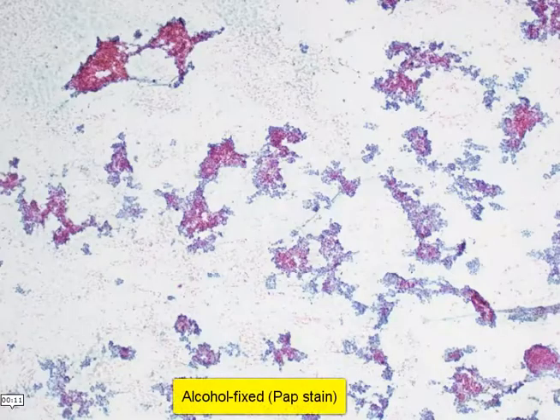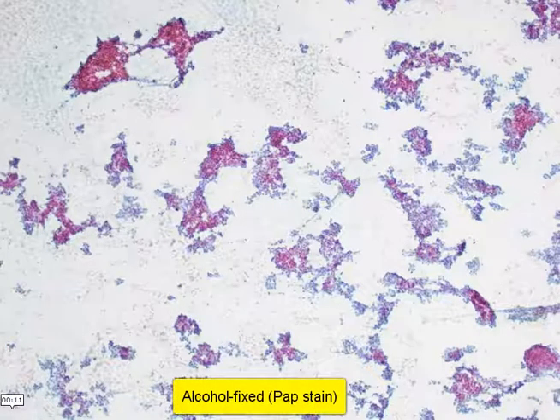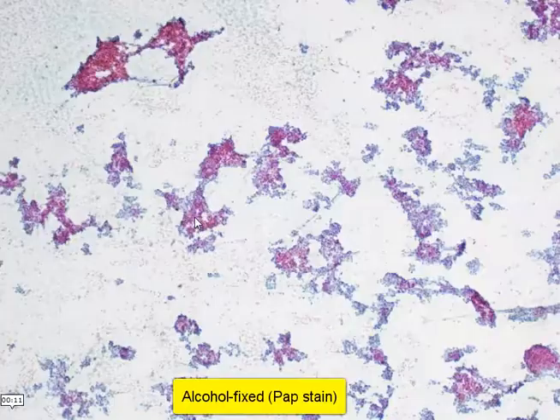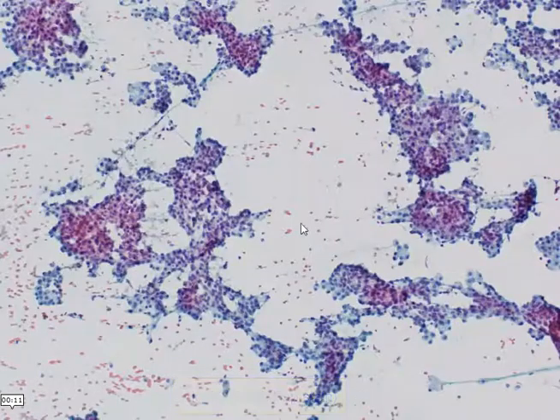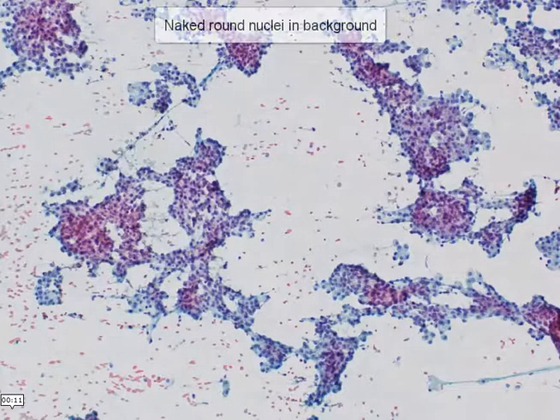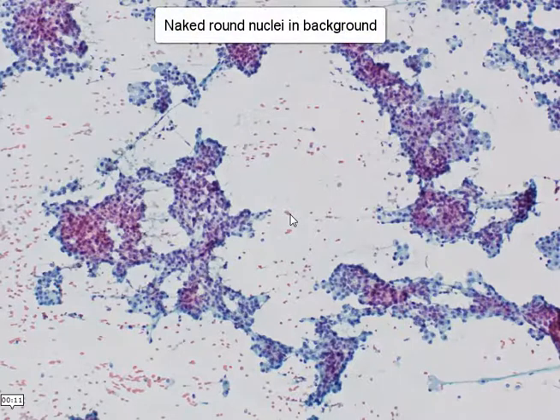Moving on to the alcohol-fixed smears, we can see a similar pattern on low power — these branching tissue fragments. Note also that there are some bare, naked, round nuclei in the background.